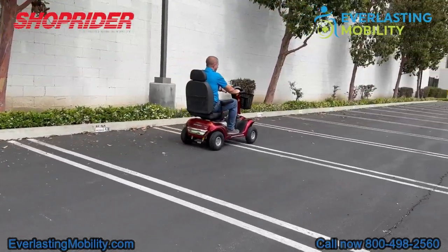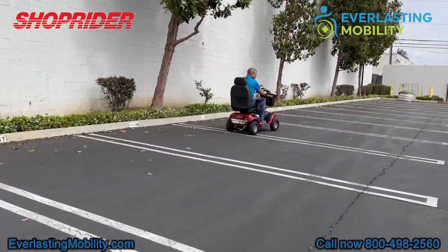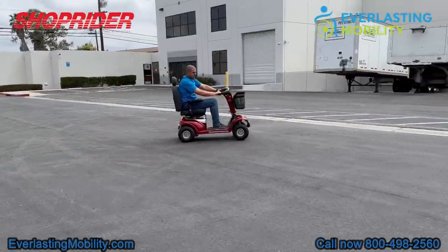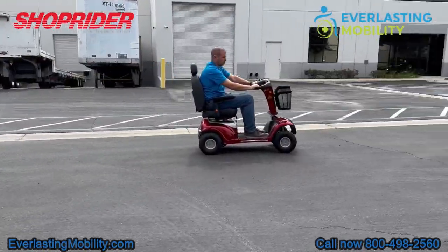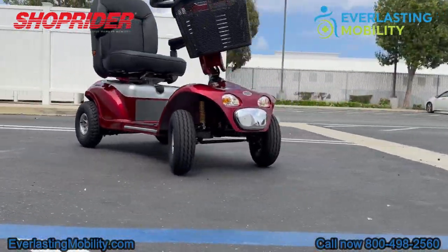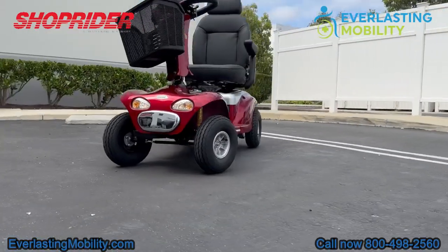All in all, the Enduro XL4 is a really nice heavy-duty mobility scooter. It's perfect for someone that's tall. It has big ground clearance, large tires, full suspension, and it's a really well-made scooter by one of the most reputable brands in the industry.